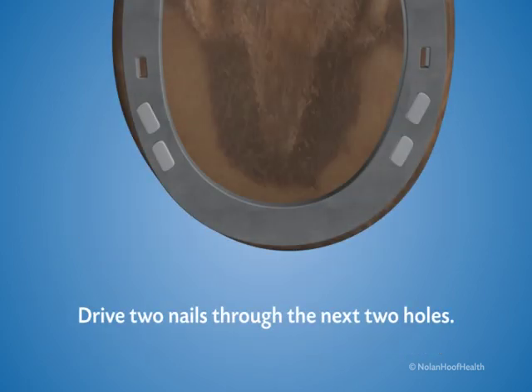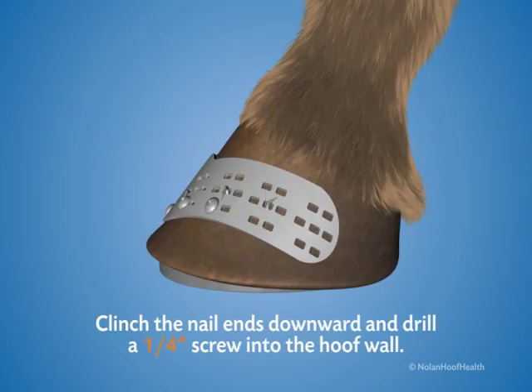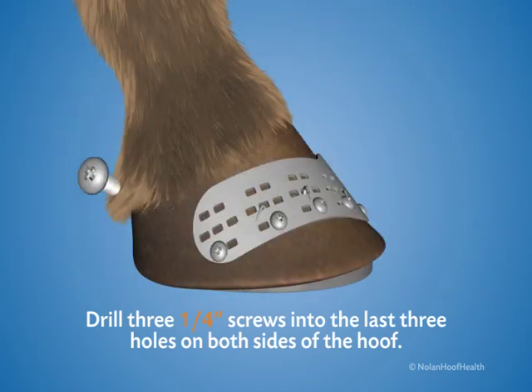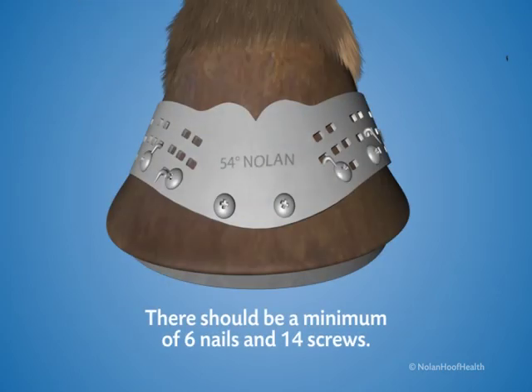Drive two nails through the next two holes. Clinch the nail ends downward and drill a one-quarter inch screw into the hoof wall. Drill three one-quarter inch screws into the last three holes on both sides of the hoof to ensure the plate does not pull away at the heel. There should be a minimum of six nails and fourteen screws on the finished application.